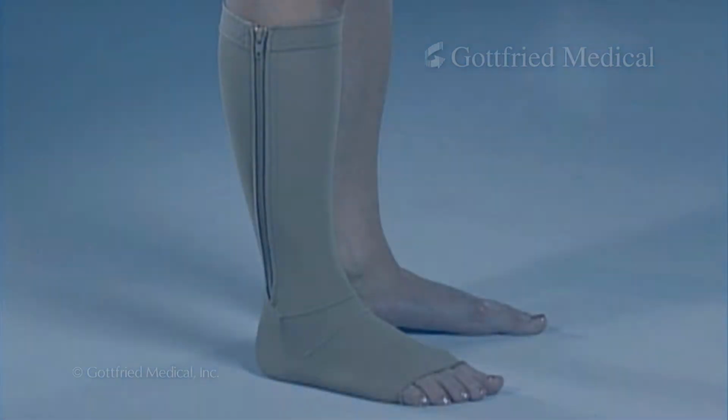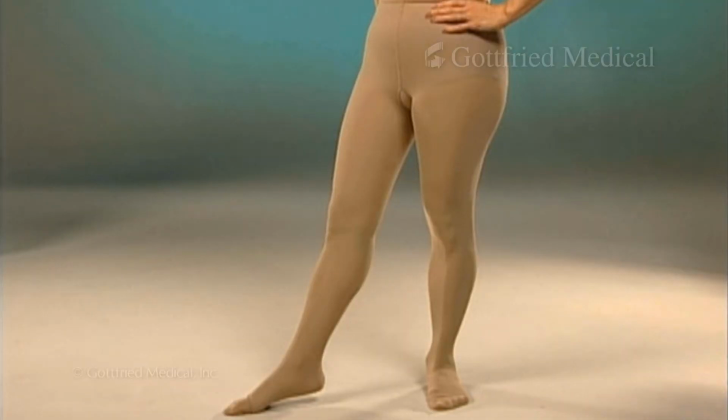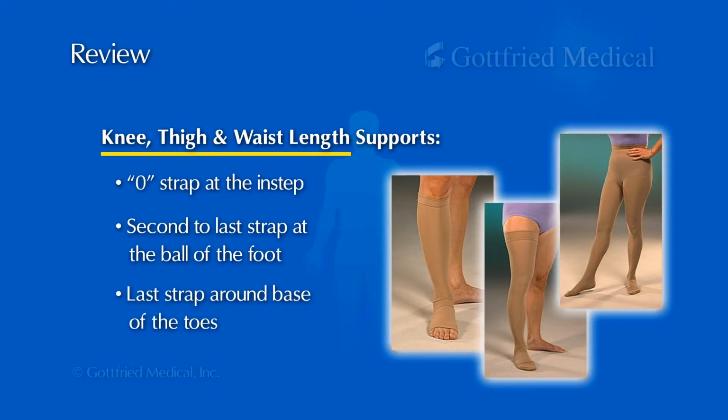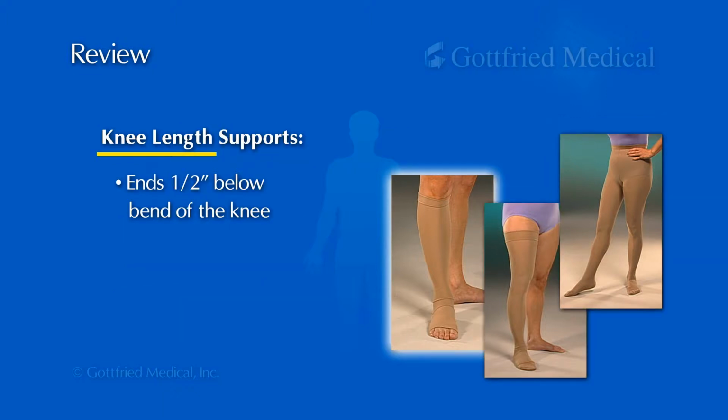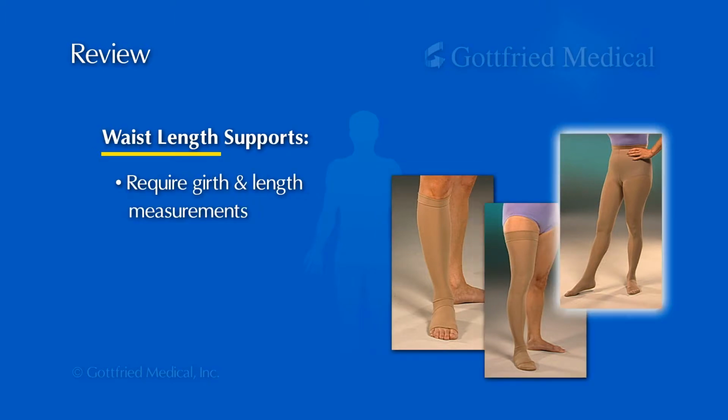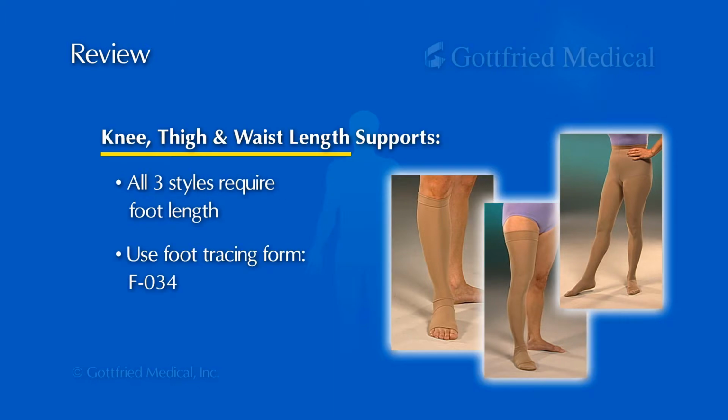Remember, when measuring for a knee length, thigh length, or waist length support, start with the 0 strap at the instep. The second to last strap goes around the ball of the foot, and the last strap around the base of the toes. The knee length support ends 1/2 inch below the bend of the knee. The thigh length ends within 2 inches of the groin. For a waist length support, measure girth and length as specified on the order form. All 3 supports require foot length.